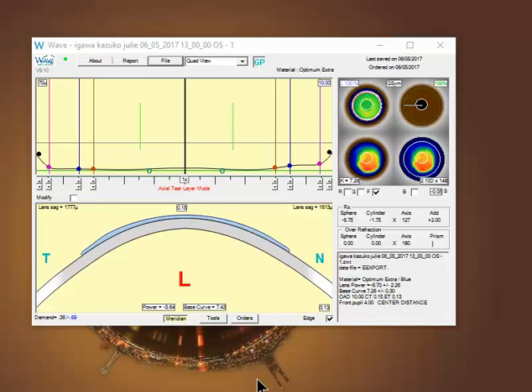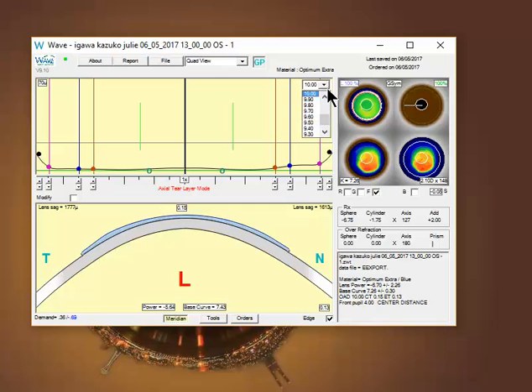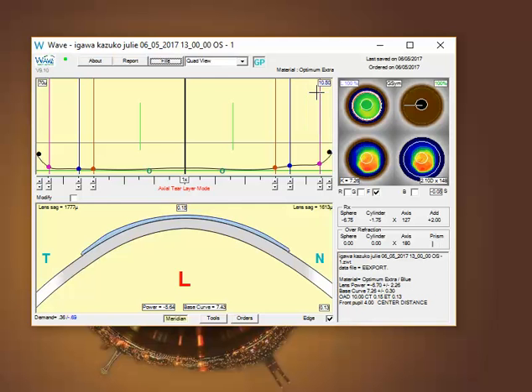To improve the performance of this lens, I'd recommend going a little bit larger in the diameter, maybe about a half millimeter or so. That'll help stabilize the lens.